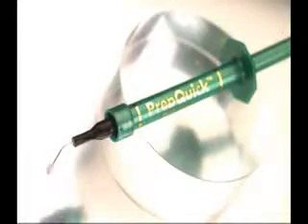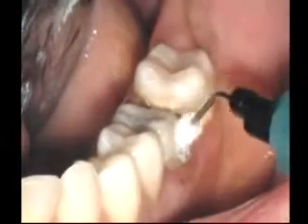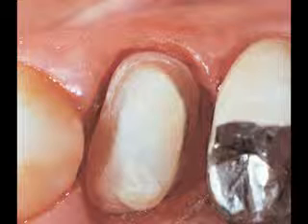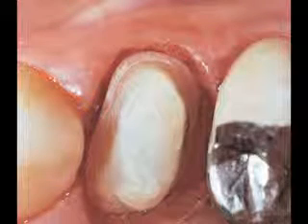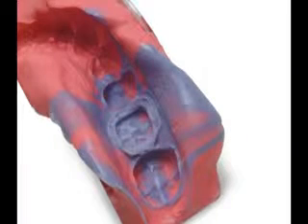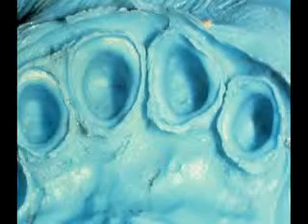Prep Quick can be flowed over the preparation to remove the smear layer, reduce surface tension, and give better accuracy in the impression. Sometimes, the gingival tissue appears dark after the infusion process. This is due to iron-precipitated coagulum in the tissues. This discoloration dissipates within 24 to 48 hours after the temporary is placed. Making an accurate impression the first time is expected if all the margins are clean, dry, and exposed. Notice the clean, highly detailed margins that are possible to achieve using this technique.